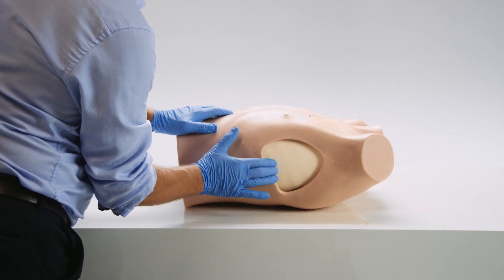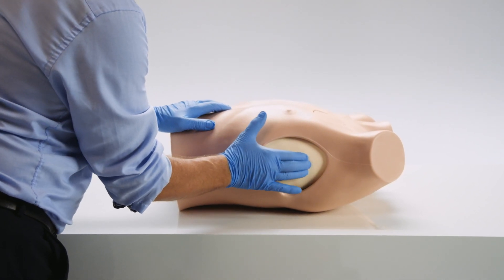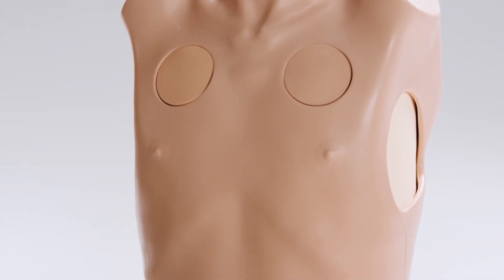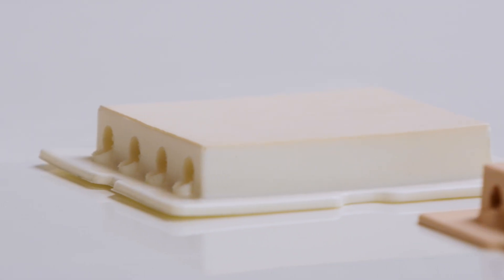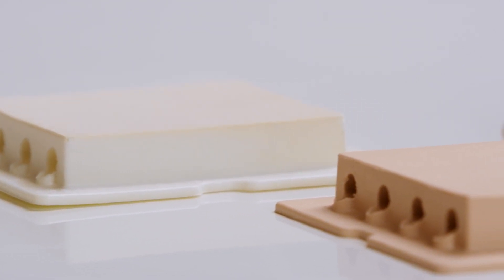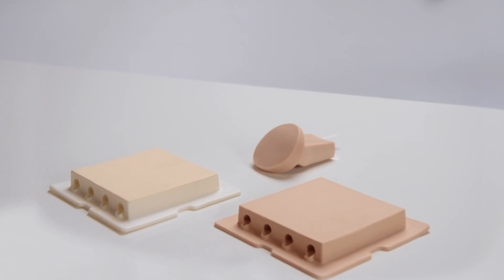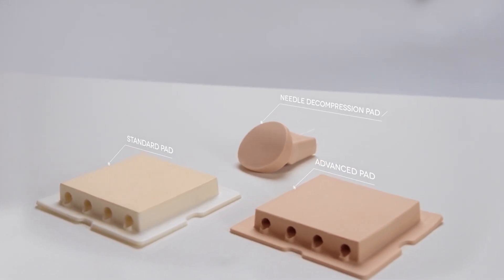It has been designed to include bony and soft tissue landmarks, as well as internal anatomy that can be viewed under ultrasound. The trainer can be used with the standard or advanced pads for chest tube insertion and chest drain. The needle decompression pads can be used to convert a tension pneumothorax into a simple pneumothorax.